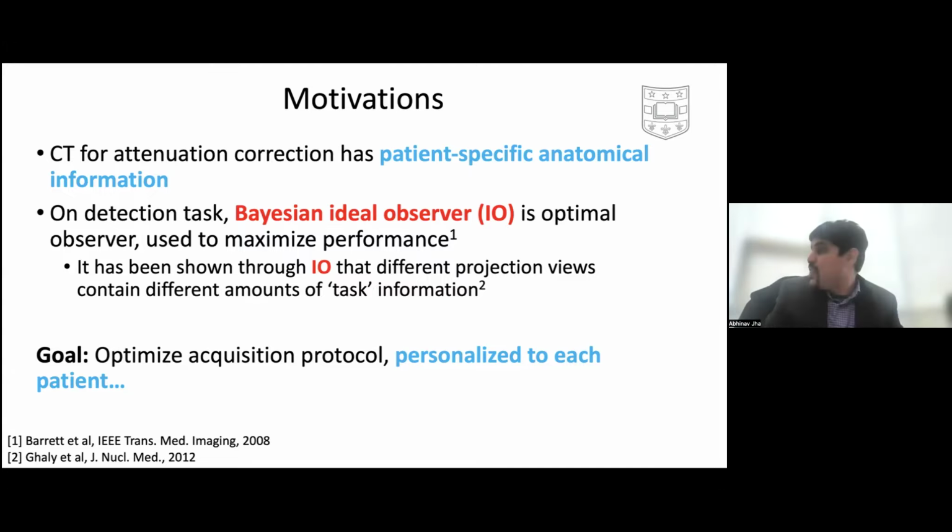For studying the reconstructed images, did you actually use human observers? Did you use anthropomorphic model observers that are not ideal? They're not. But we also did human observer studies, not statistically powered. These were just showing them samples, showing them some views and asking them the question, is it or is it not? And this is work in progress at this stage.